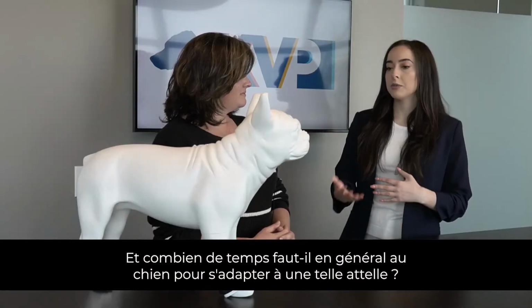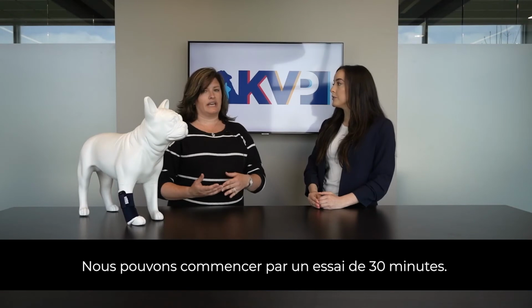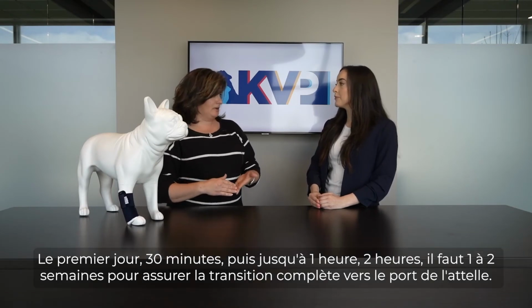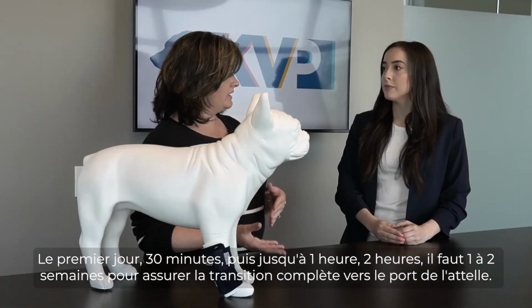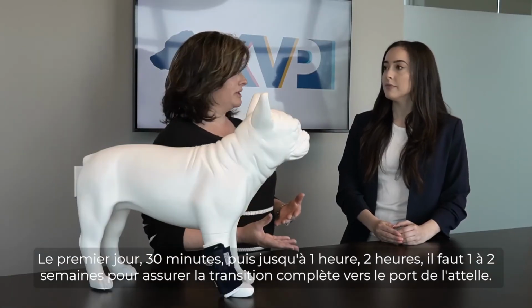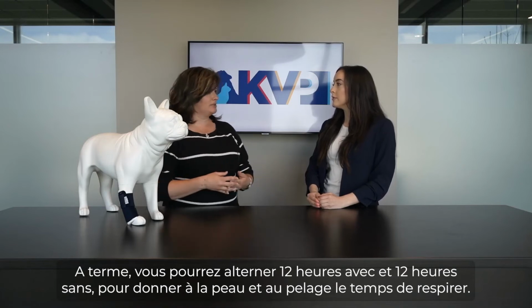And how long does it typically take for your dog to adjust to a brace like this? So we want to start with, say, 30-minute increments. So the first day, a 30-minute wear, then up to an hour, 2 hours. Take 1 to 2 weeks to fully transition them into wearing the brace. Ultimately, we want 12 hours on, 12 hours off, giving the skin and coat time to breathe.